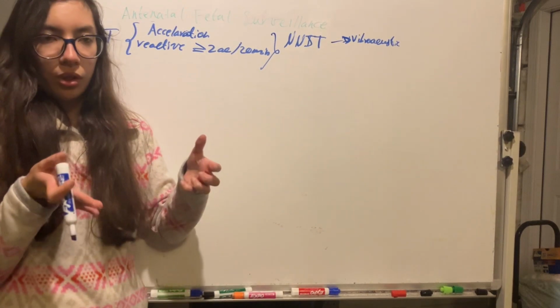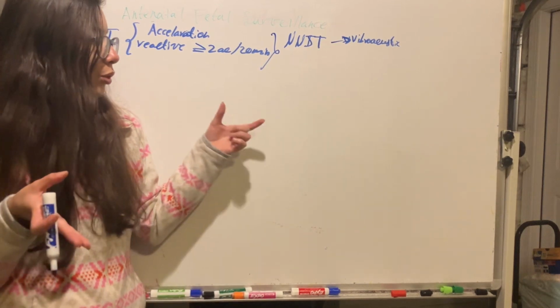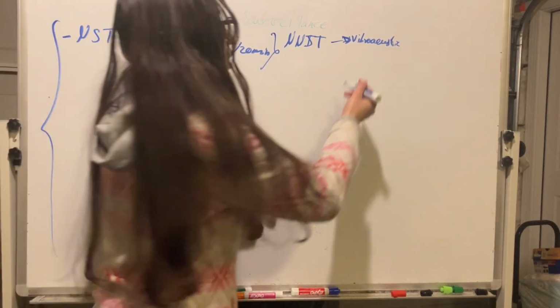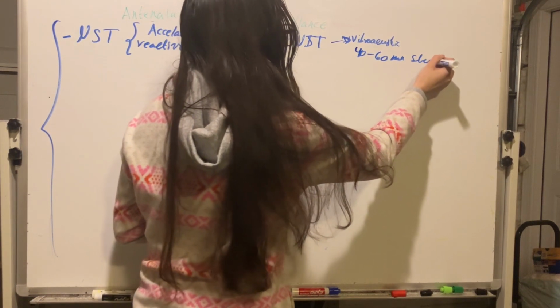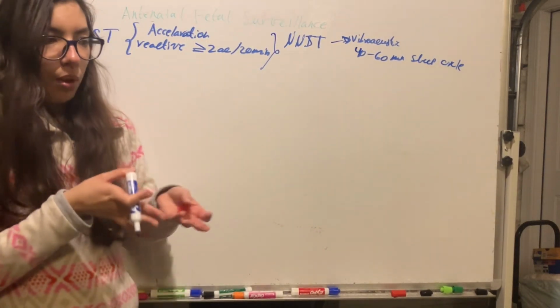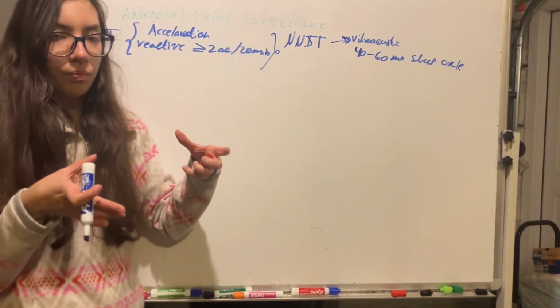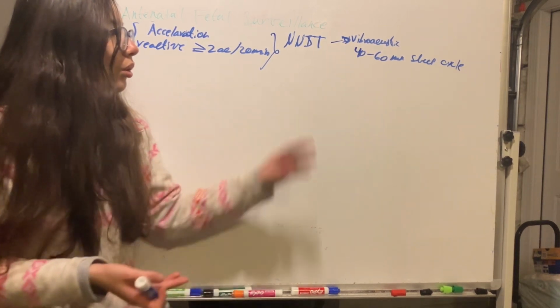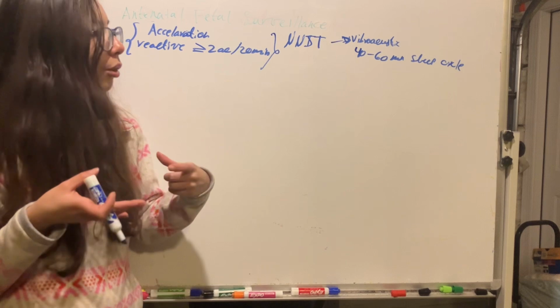and we also want to be sure that the period for which we are evaluating the fetus is awake. The sleep cycle is like 40 to 60 minutes. So for that we normally do the non-stress test for about 40, 60, 120 minutes to make sure that we are evaluating the fetus at least in some part when the fetus is awake. We can do vibroacoustic stimulation to stimulate the fetus to wake up.